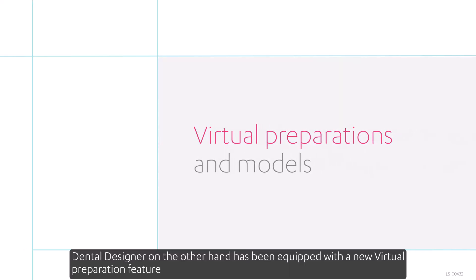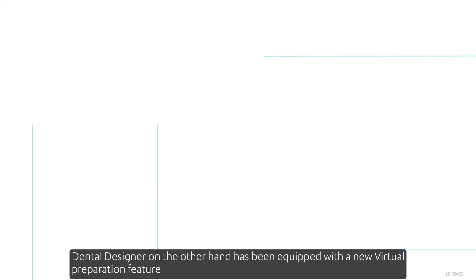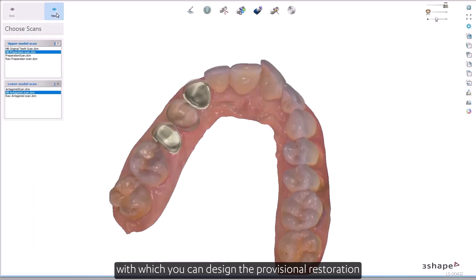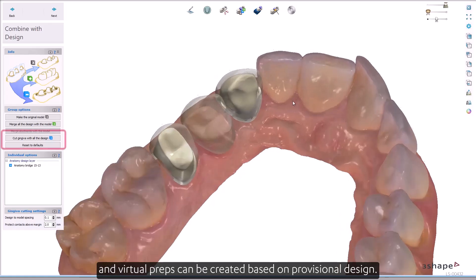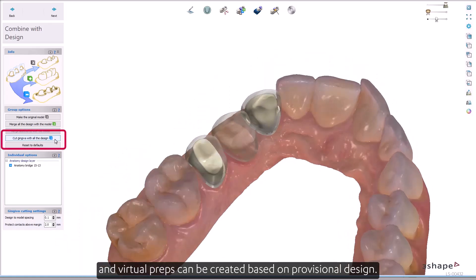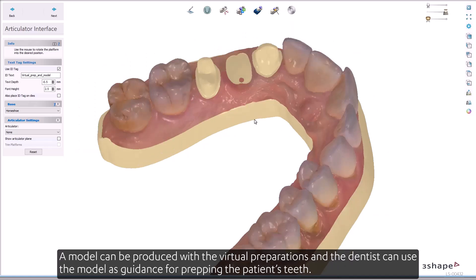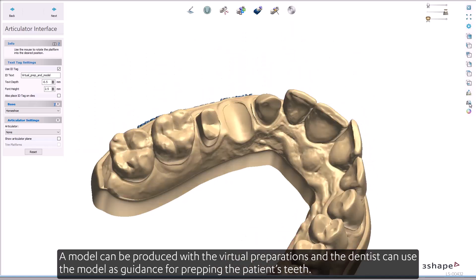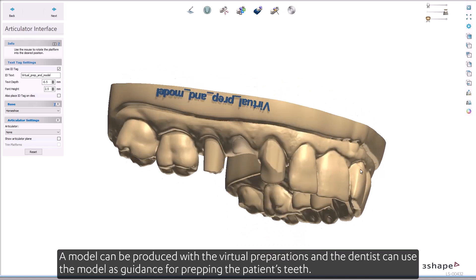Dental Designer was equipped with a new virtual preparation feature, with which you can design the provisional restoration. Virtual preps can be created based on a provisional design, and a model can be produced with the virtual preparations so the dentist can use the model as guidance for prepping the patient's teeth.